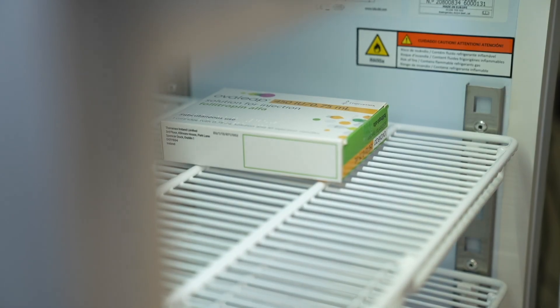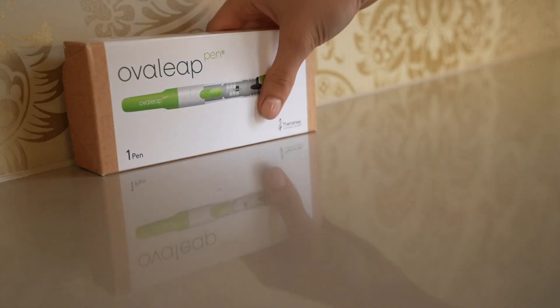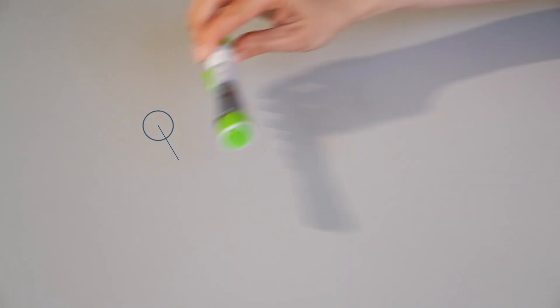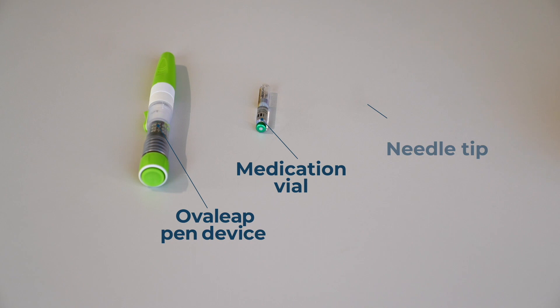The injection comes as two parts: the medication, which should be stored in the fridge, and the plastic pen, which can be stored anywhere. Start by assembling the equipment. You will need the pen device and, from the medication box, a vial of medication and one needle tip.